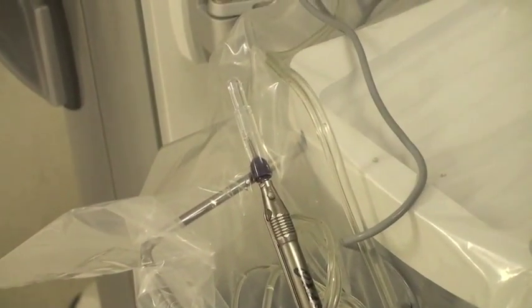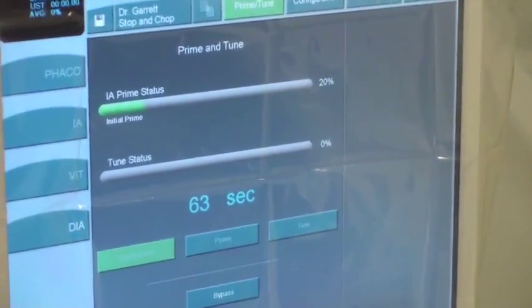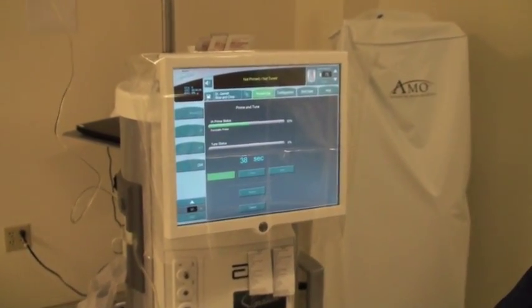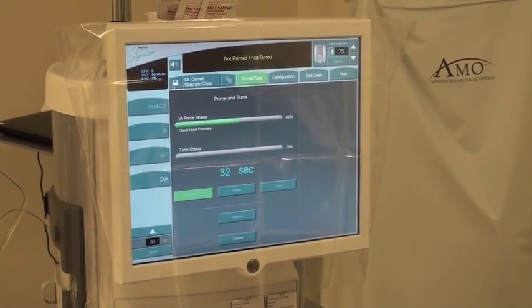The machine is going to run through its tests, and once it goes 100% complete on both, then your phaco handpiece is calibrated. As you can see, it's counting down on the screen showing how much longer it has to go. While this is going on, you can be setting up the rest of your tray, because you don't really have to do anything while it's calibrating.